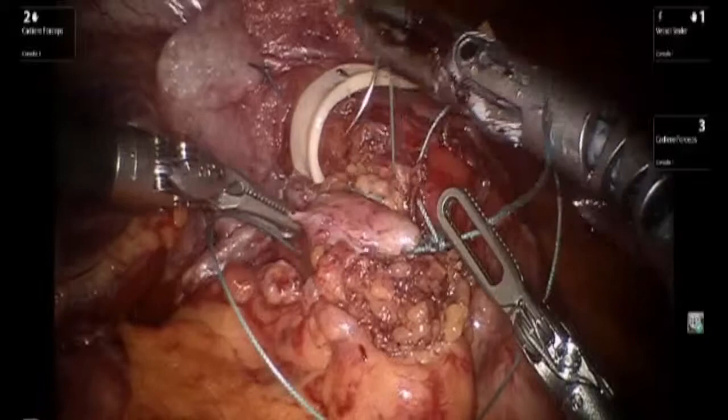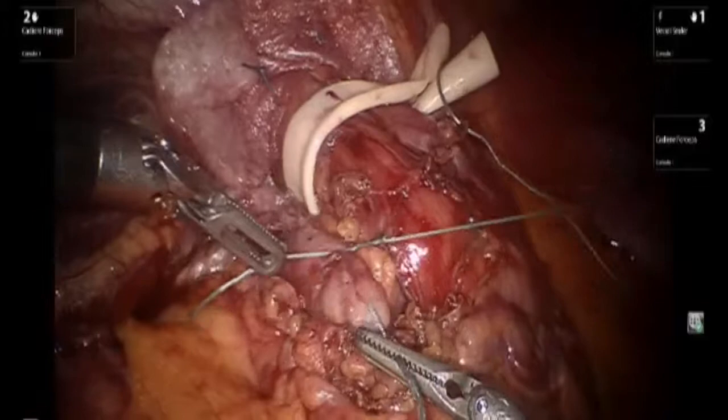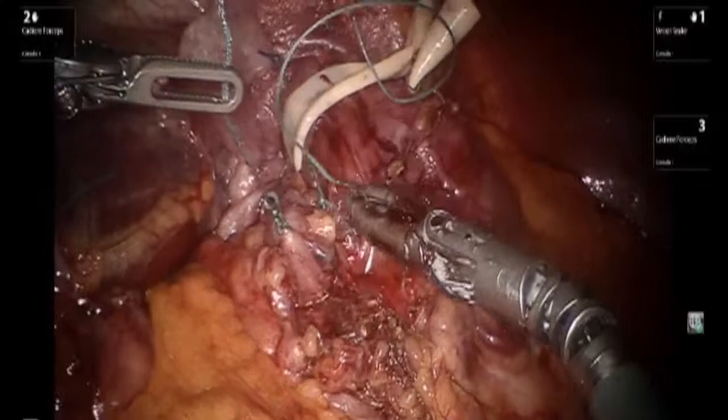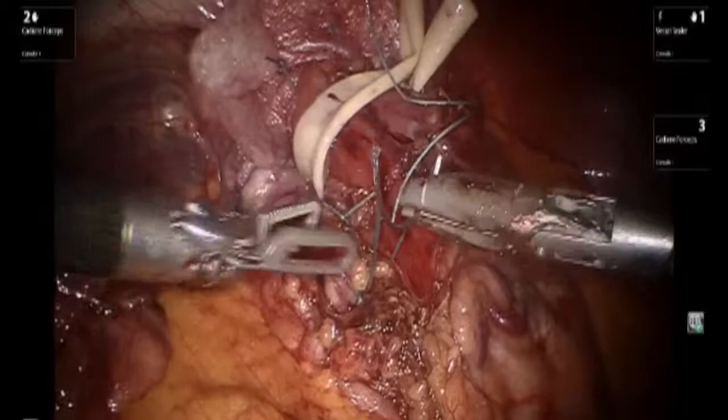Even though great care was taken to completely mobilize the cardia and to take the short gastrics down, it was felt that doing a complete wrap would provide too much tension and possibly cause dysphagia postoperatively, and therefore the decision was made to perform a posterior Toupet fundoplication. Multiple sutures of esophagus to a portion of the cardia are placed in order to perform the 180-degree wrap.